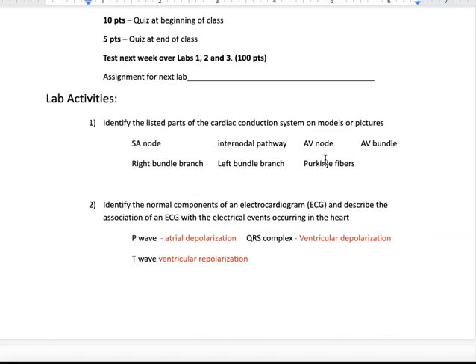So if someone yells to you and you're in the emergency room saving the world, we need an EKG. You're going to hear that very distinct. EEG and ECG sound very much alike, so they're not distinct. That's why you see EKG used a lot.